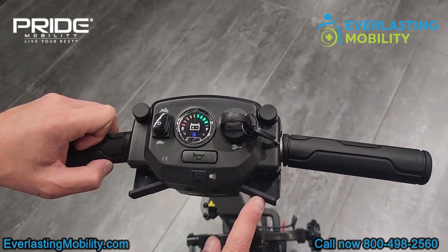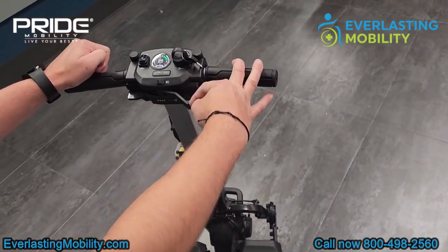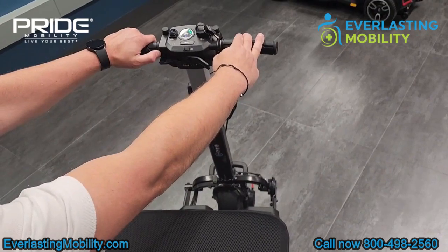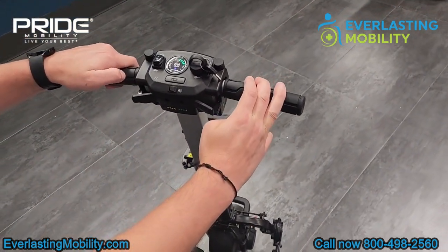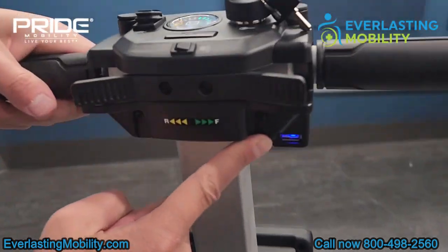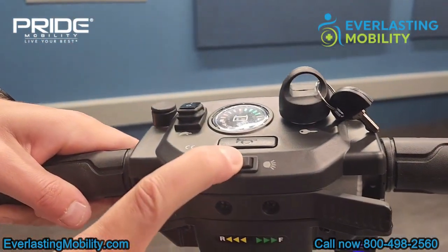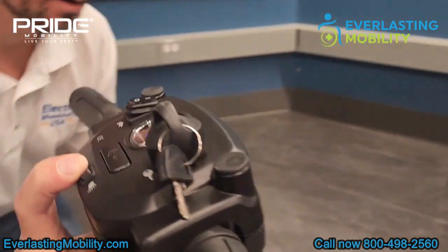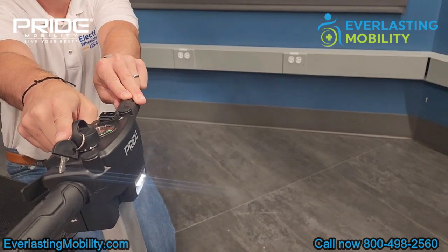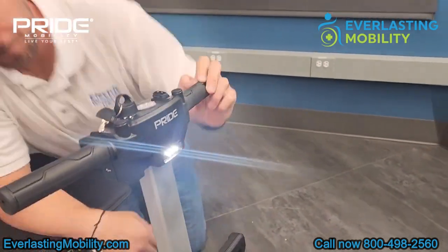This is your horn button, and the tiller's throttle control is ambidextrous. So if you had limited mobility in one hand, you can accelerate forward or backwards with just one hand. There's also a convenient USB charging port so you can charge your cell phone while on the go. Here's the light switch — if I turn that on, you can see the front headlight turns on, which helps when driving at nighttime. A lot of folding scooters don't have a headlight on the front.